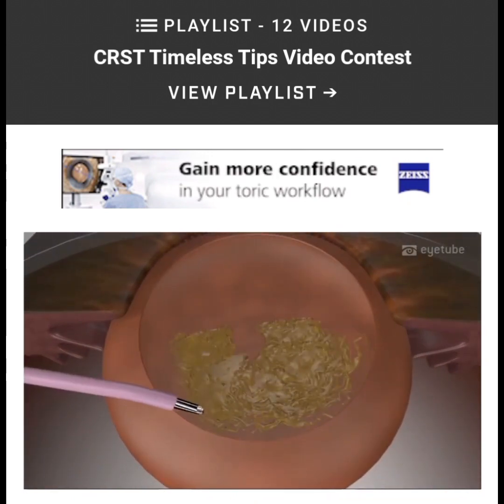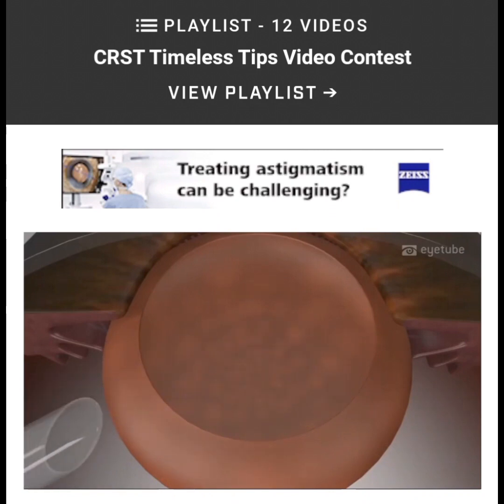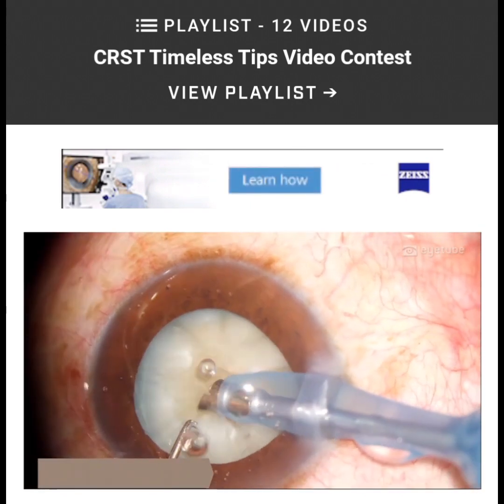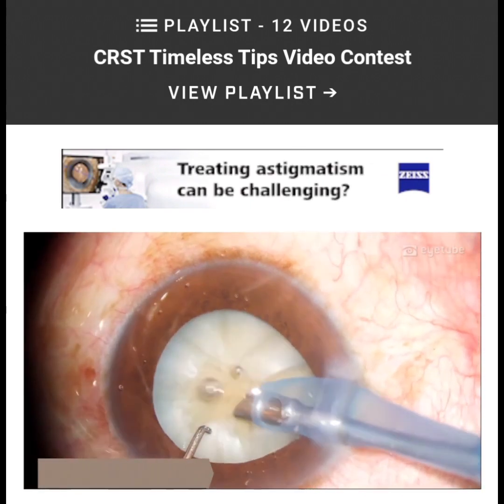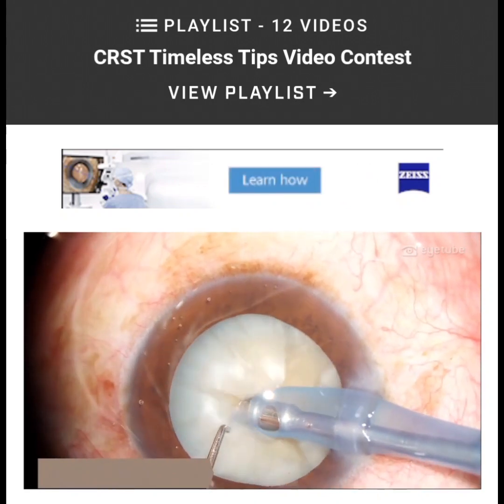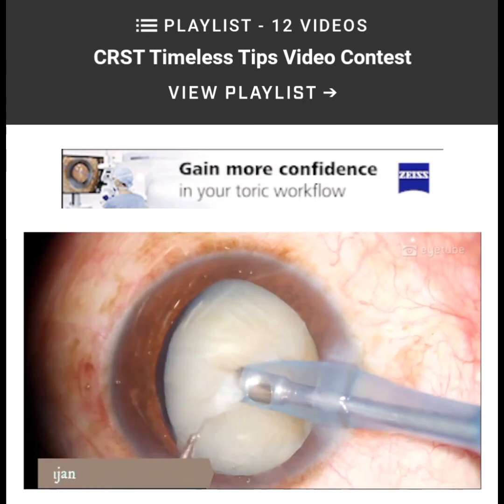The idea is like this, so that fellows, young surgeons, who don't have such an idea during chopping, are safe. So that's how you do it in a real life scenario. For experienced surgeons also, I think I'm using this for many of my hard cataracts. So this is how you do it in the real life scenario.